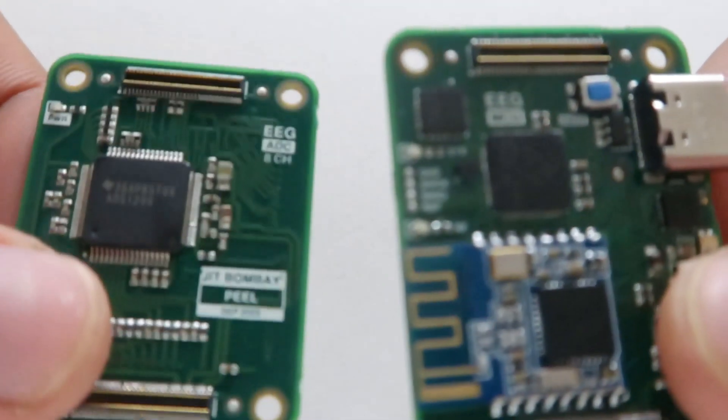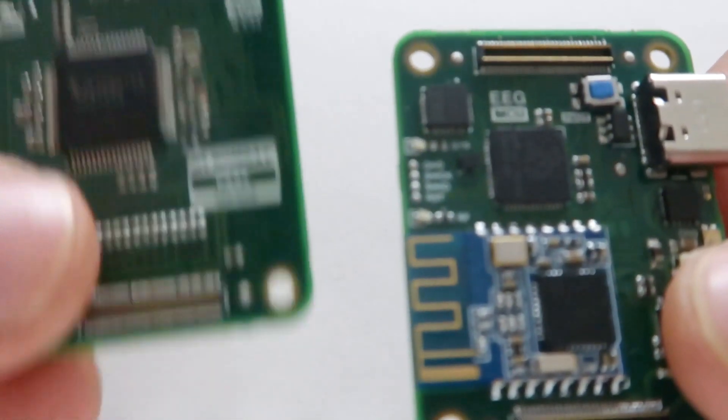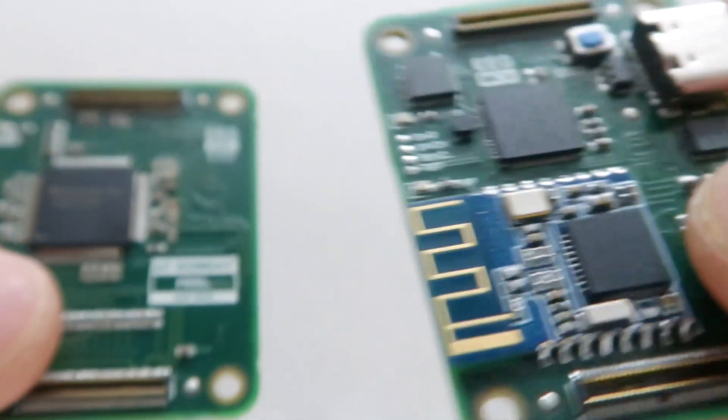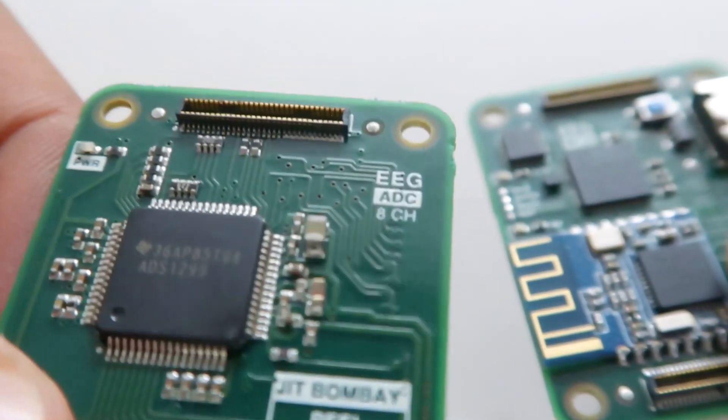The hardware of the first revision of the wearable EEG project is made out of two boards. One is the EEG MCU board, which is the MCU stack, and the other is the ADC stack.